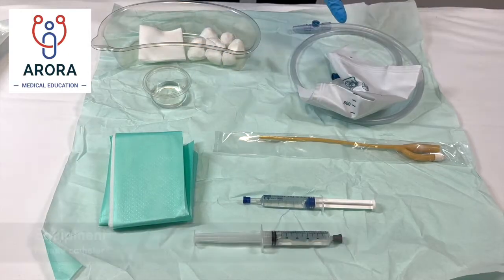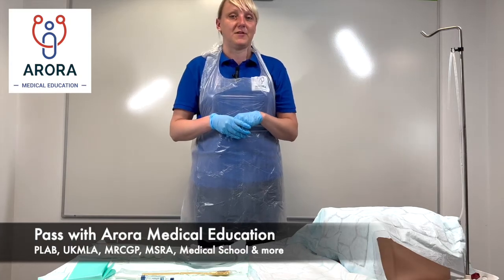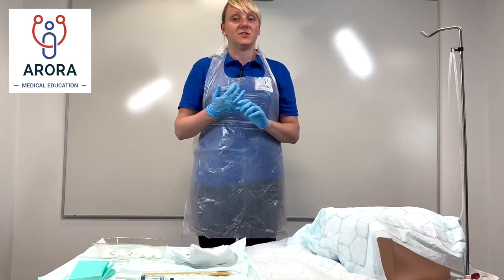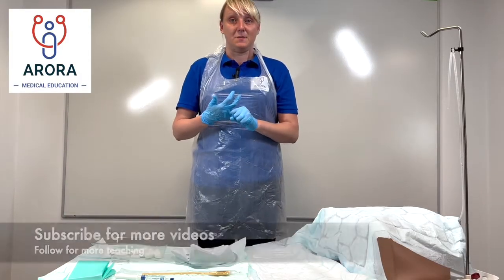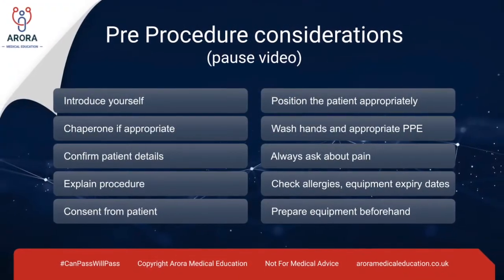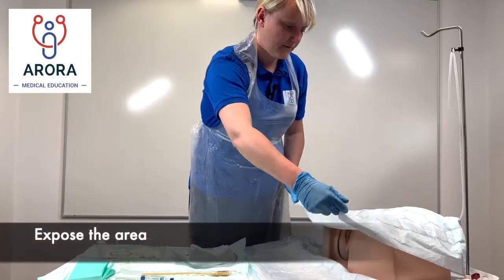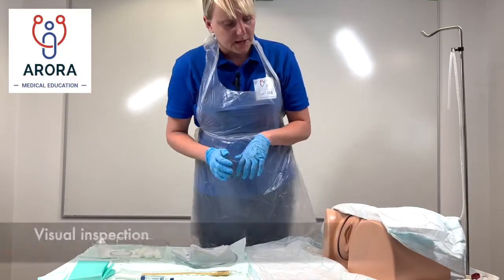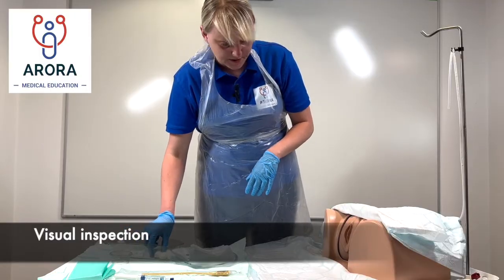And a catheter bag to collect the urine. Now we'll go through step by step how to insert a female catheter. As in the first video, we want to ask the patient's consent, explain the procedure to them, offer a chaperone, and check if they're in any pain. First of all, we need to tell the patient we're going to expose the area ready to insert the catheter, and do a visual inspection to check that the area is clean.